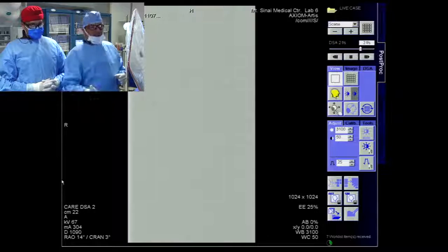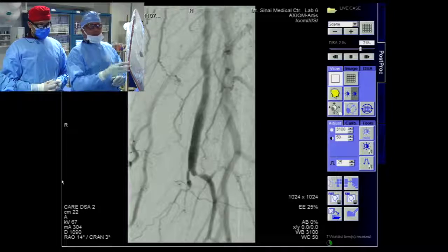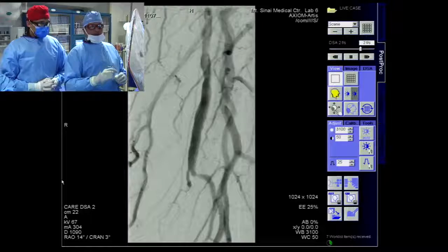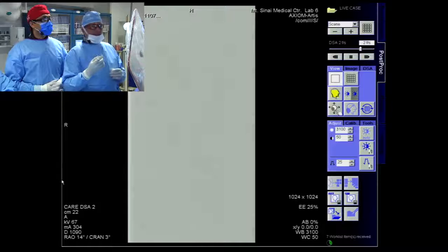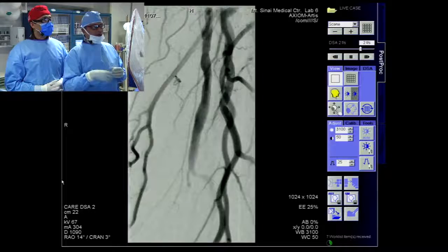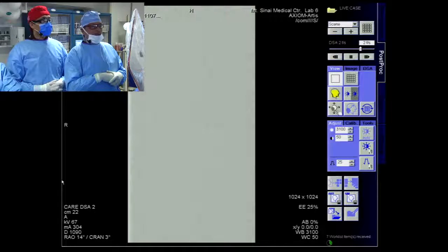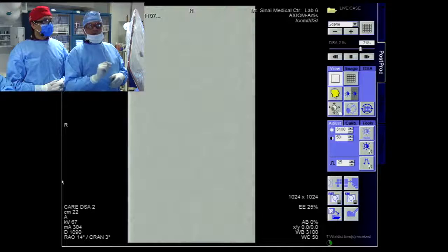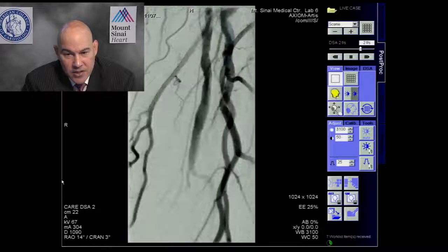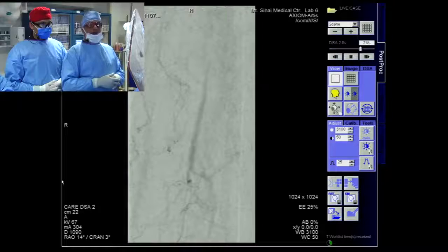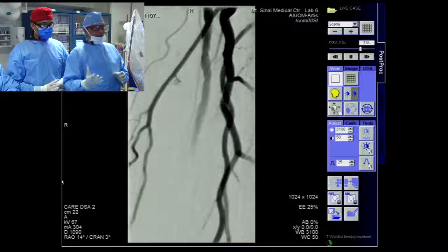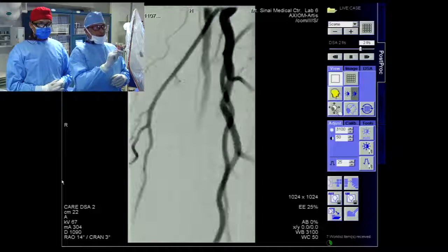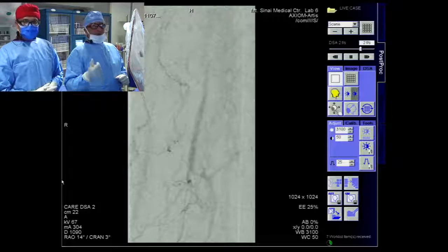Our algorithm: whether we have a beak with or without multiple collaterals, we use a directional catheter — an angled vertebral-type or non-tapered tip catheter — to direct the wire away from collaterals. We work on roadmaps so we don't advance blindly. Through a 7 French sheath, we use a support catheter such as a vertebral tip catheter to direct the wire toward the stump. This allows us to choose either a subintimal or true luminal approach.